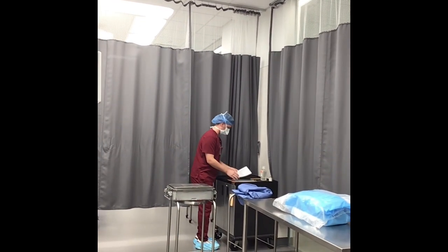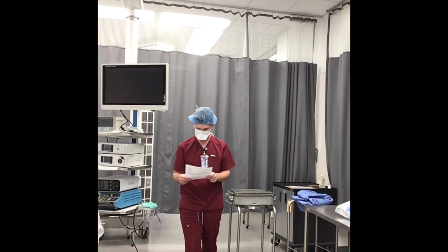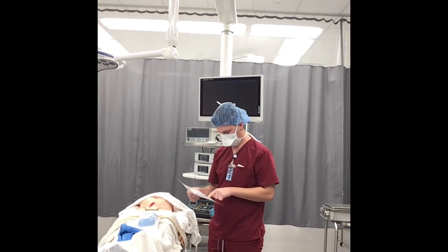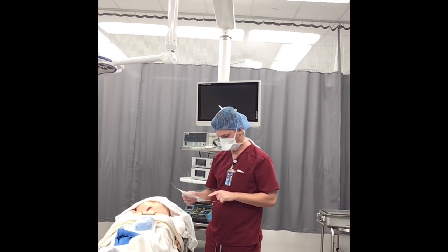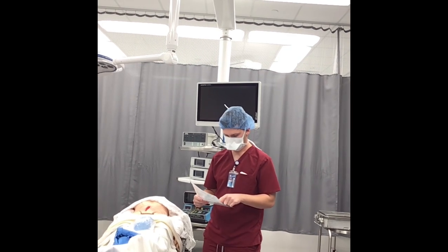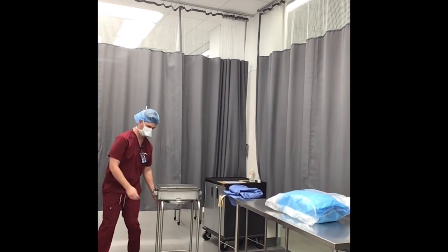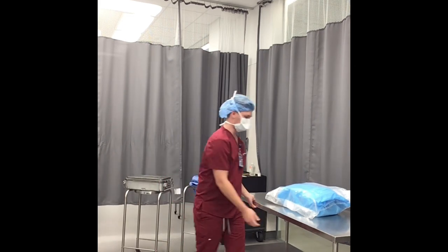Okay, so I'm going to give this one look over to make sure I have everything accounted for opening. So I have my gown, my gloves, Raytex, my laps, laparotomy pack, light handles, my basin. And yes, I am ready to go. All right. So I'm creating space again, like I said.